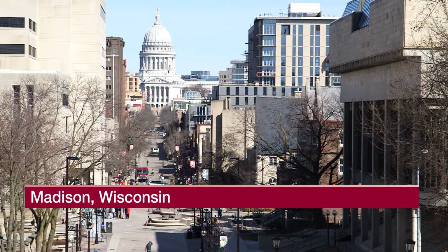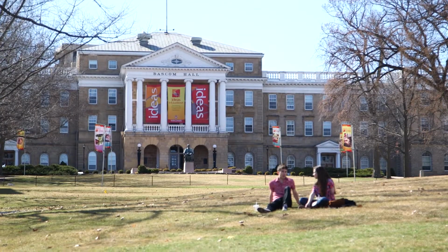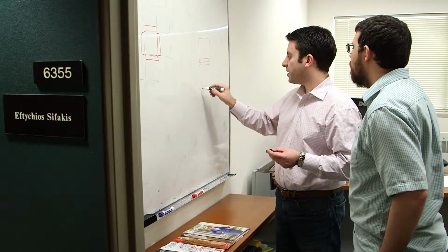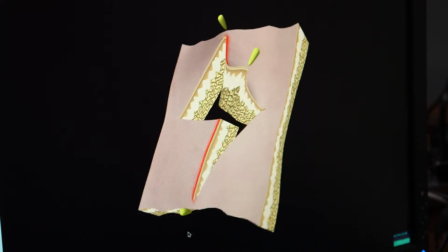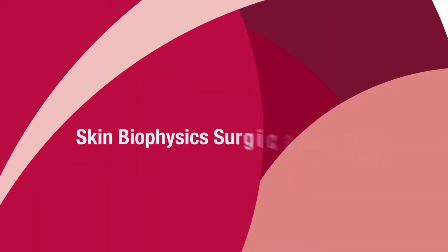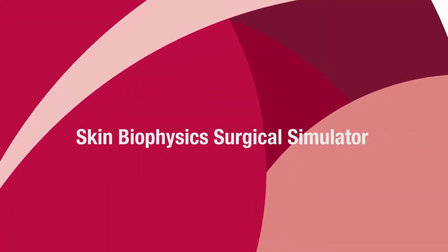At the University of Wisconsin-Madison, we are engaging in a very exciting interdisciplinary activity between computer science and medicine. Our product is a computer-aided platform which allows surgeons in training to rehearse, plan, and experiment with different surgical procedures before actually trying them out on a real patient. The research program is called the Skin Biophysics Surgical Simulator. One way to think about our tool is as a flight simulator for surgeons, where they can practice the operation without putting the patient at risk.